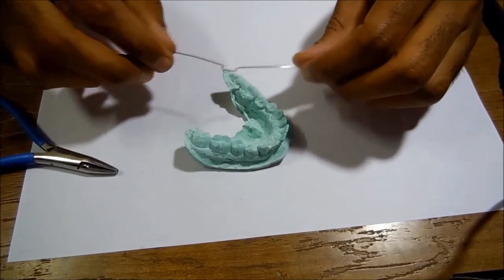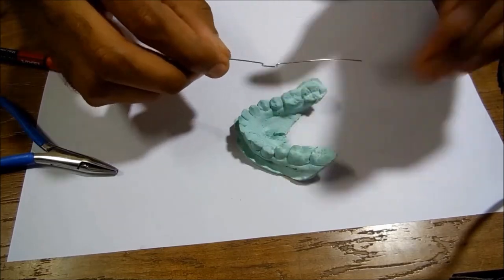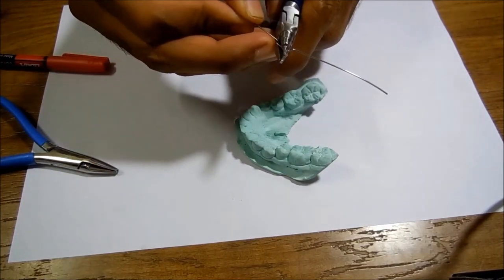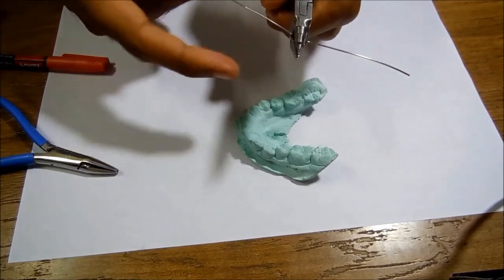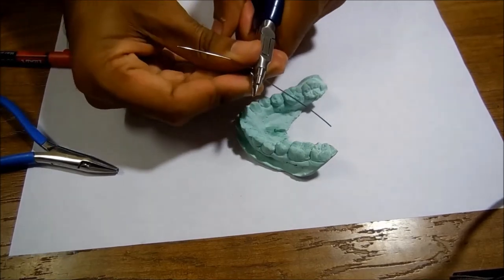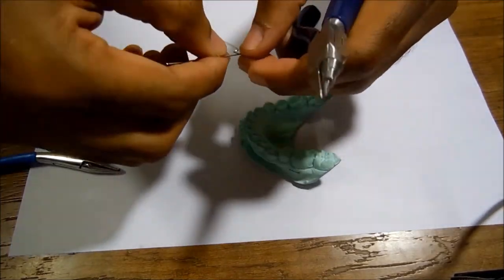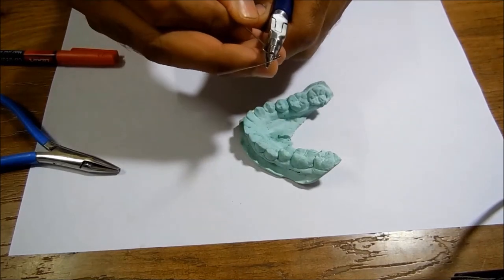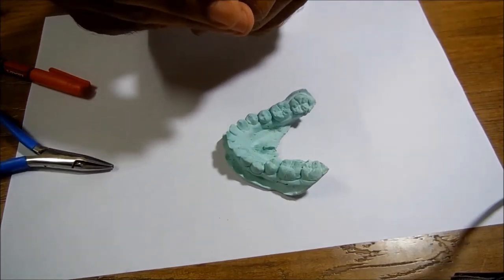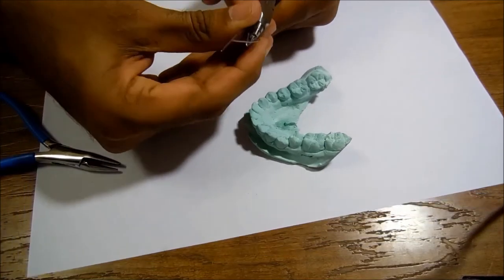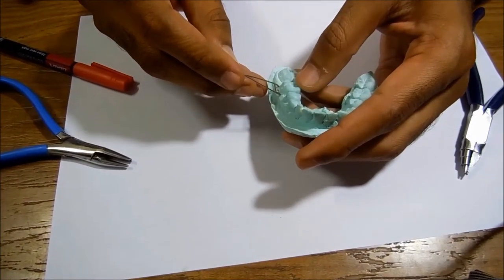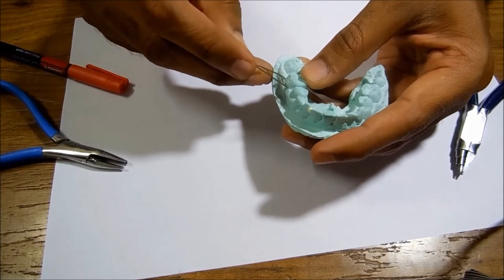Now after deciding the height of my Adams clasp, I need to give the arrowhead bend. This is something you need to very carefully see. I'll be holding this at this edge of my plier, hold it tight, and give it a bend like this. I'll show it on the other side as well. Hold it tight at this part of the Adams plier, give it up, hold it very tight. You need a good plier for this step and do it like this.